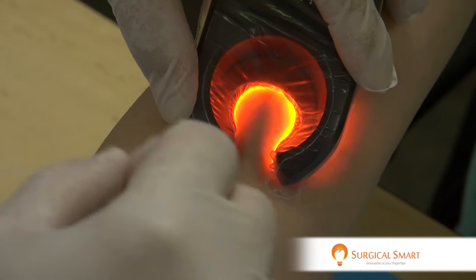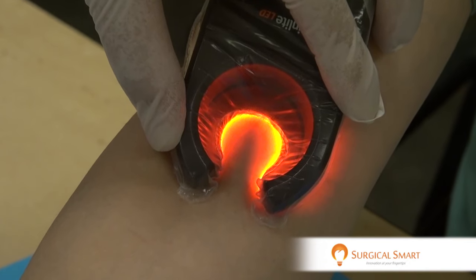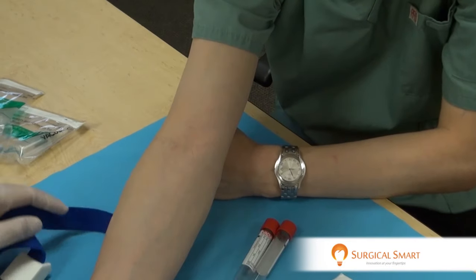So, for those of you who have problems getting a good blood draw, the VeinLight solves a great deal of your problems. Let's perform a demonstration.